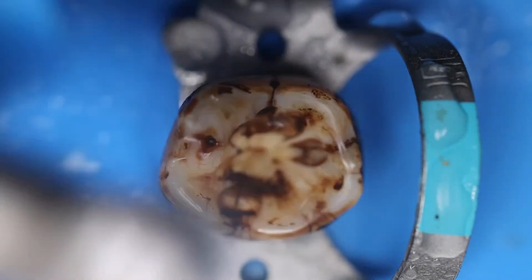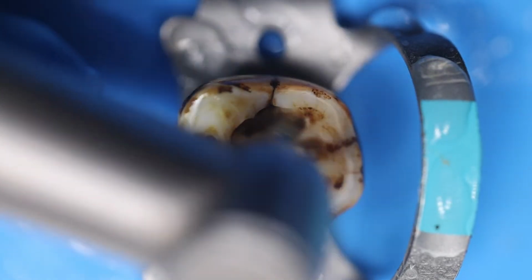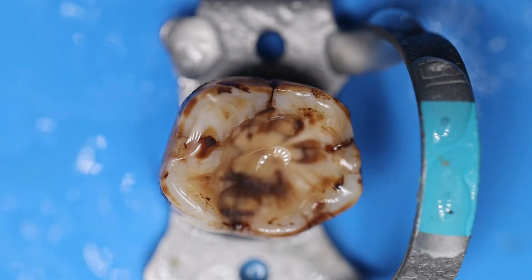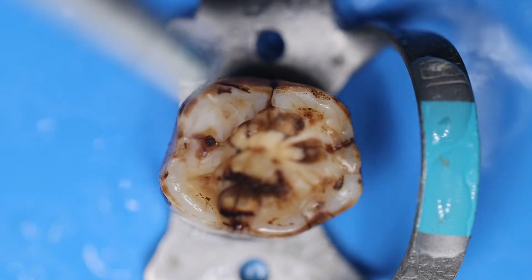Now you can see that we are into the center. We have almost removed the carious part. Grossly we have removed it. Let us once use the three-way syringe so that you can see it clearly what is the part that we have removed.